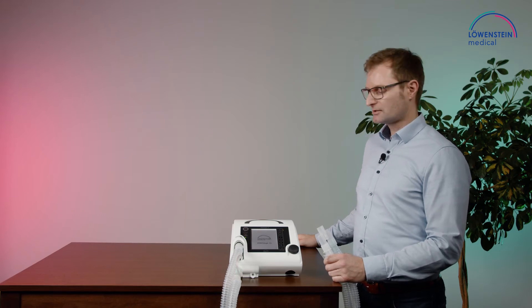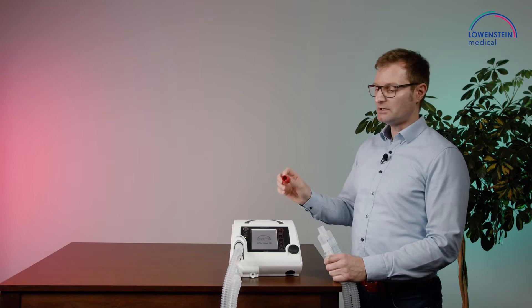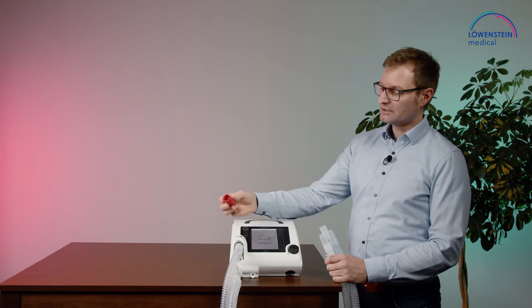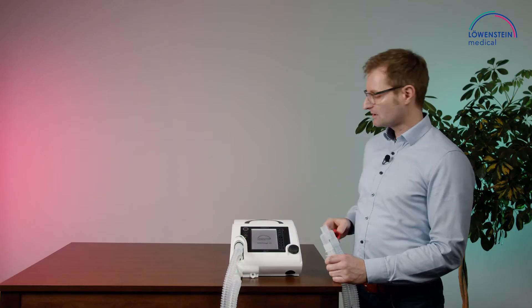To do the function test, we need an adapter. For the leakage system, we need this adapter. All adapters are delivered together with the device. This adapter would come directly at the device outlet.